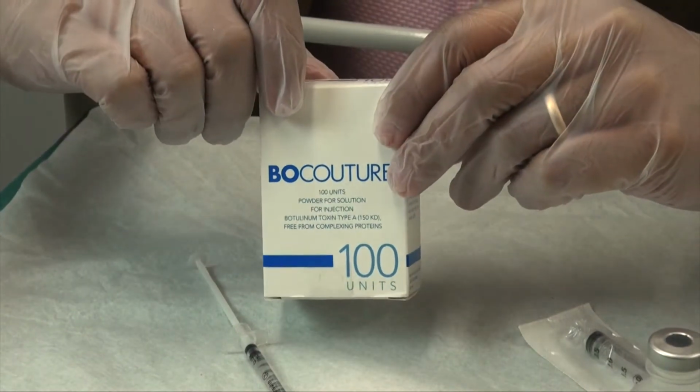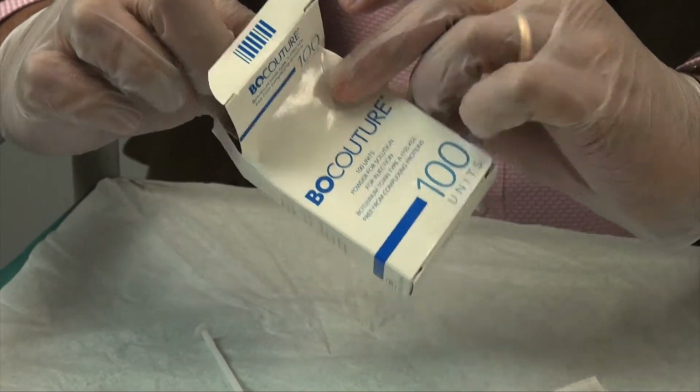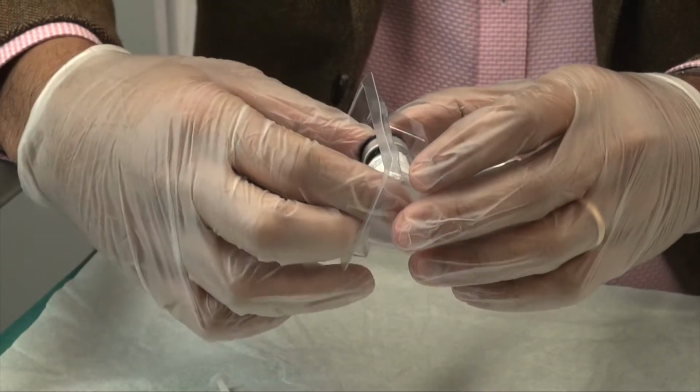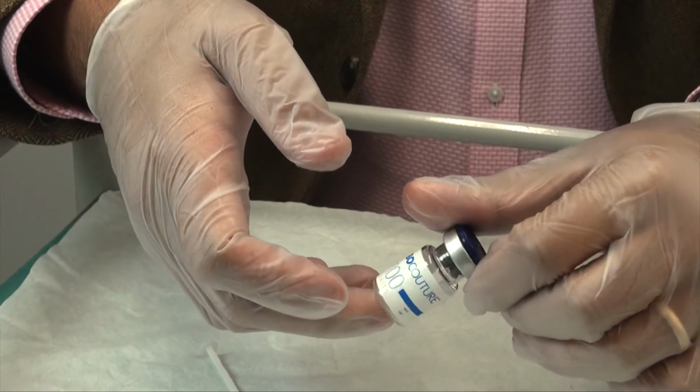Now for the reconstitution of the 100 unit Bocouture vial. In much the same way as with the Allergan Botox product, we're going to use bacteriostatic saline again for reconstitution. The Bocouture vial comes in 100 unit format as such. Let me just remove the packaging and reveal the vial. Here we have 100 units of Bocouture.